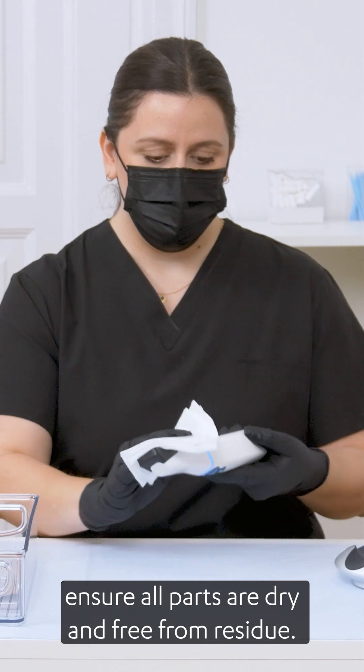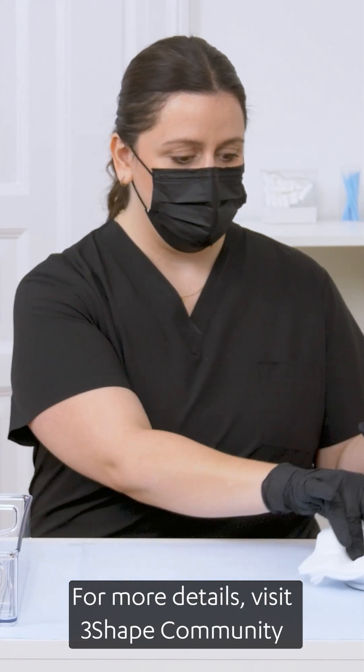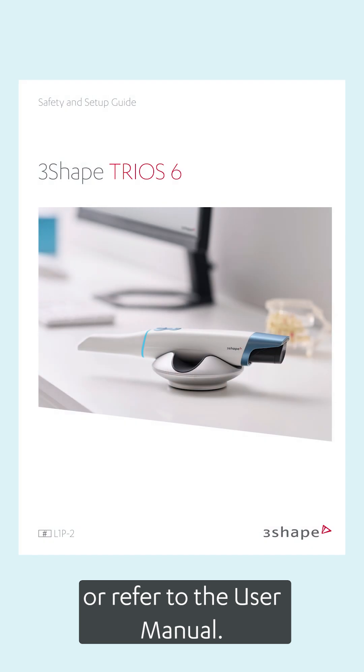Before using the scanner again, ensure all parts are dry and free from residue. For more details, visit 3Shape Community or refer to the user manual.